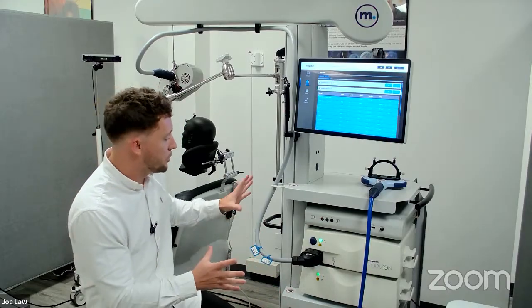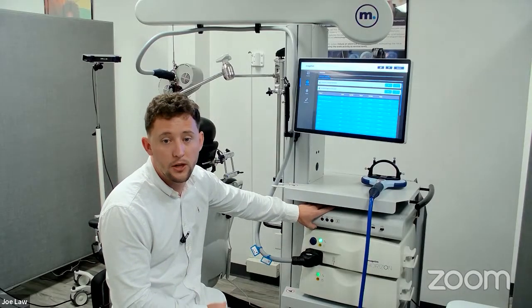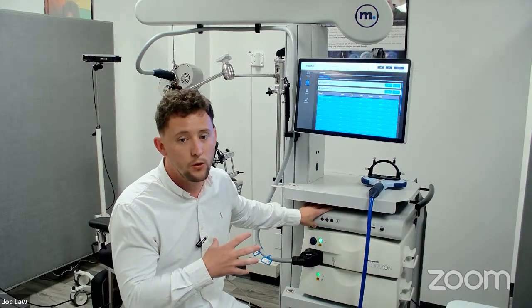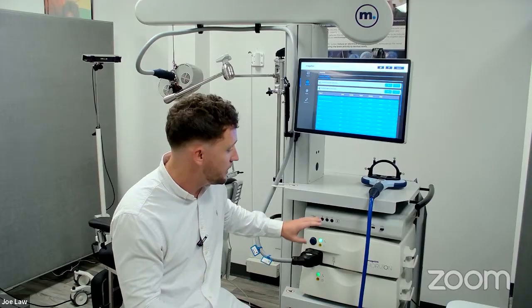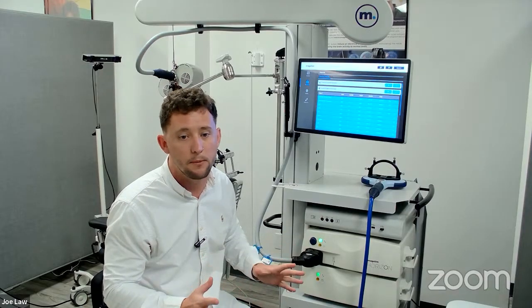Say, for example, God forbid something does go wrong, and we find out, for example, it's this top unit, we can ship you that overnight. So if you go down one day, we can ship you the modular unit overnight. It'll be with you 10:30 the next morning. It's very much plug and play. So you just swap the units out and you're back up and running within 24 hours.